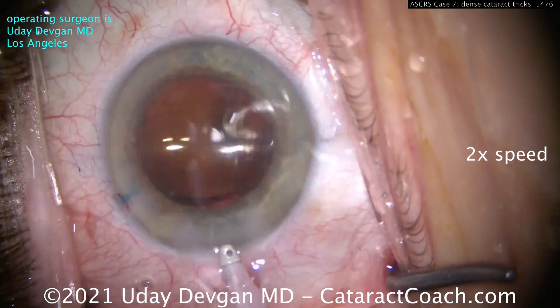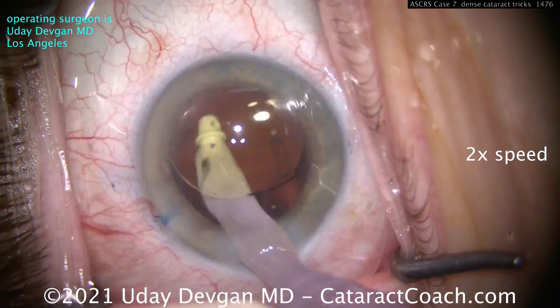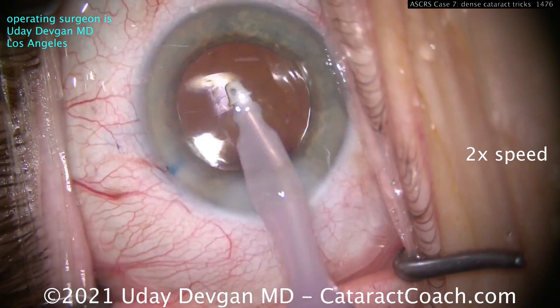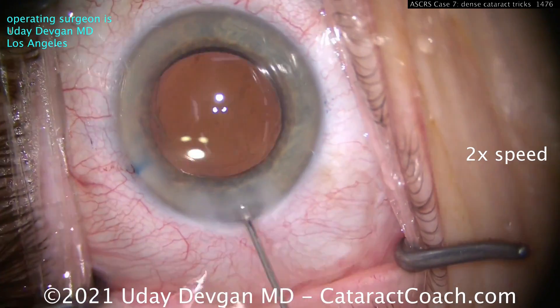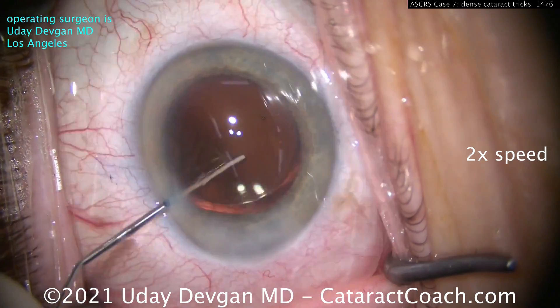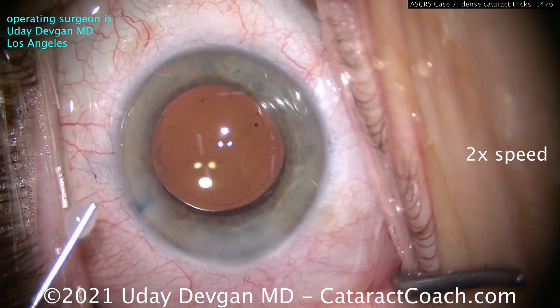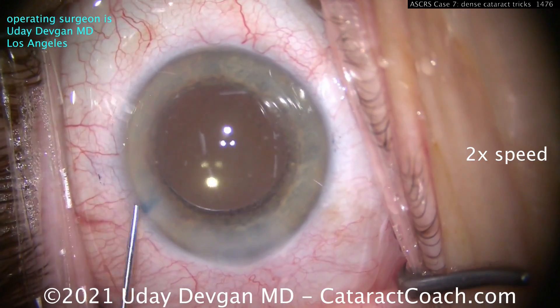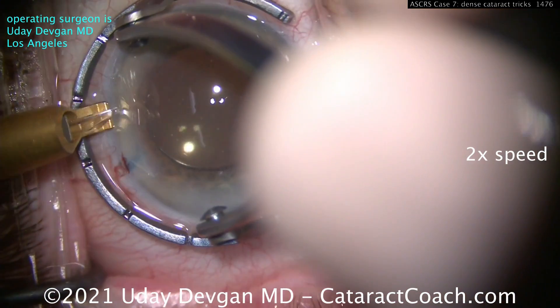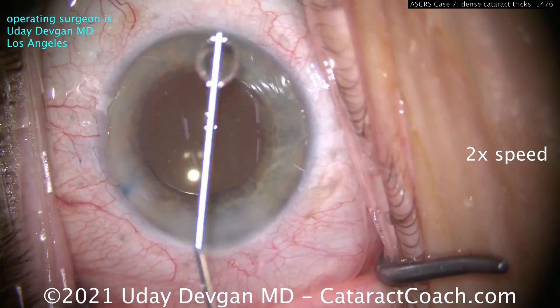At the end of the case, we've minimized the total energy in the eye. We've protected the cornea multiple times with viscoelastic. We're able to get the lens in the capsular bag — it looks really nice and this patient will have a beautiful outcome. I'm definitely going to put some triamcinolone in the AC at the end of the case to quell inflammation, because I expect more inflammation since we've used a lot more phaco energy and more fluid through the eye. There's a little LRI at the end, and that looks great.